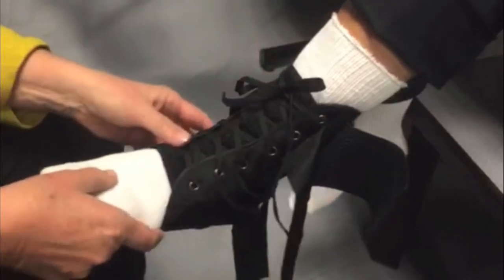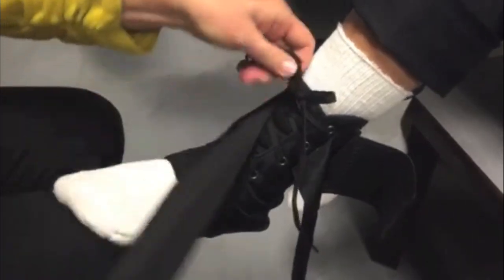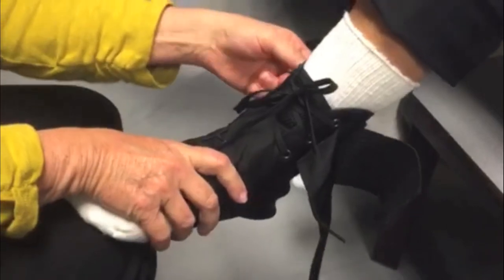Next, bring the inside or medial stabilizing strap across the top of the foot and under the heel. Attach the loop end of the strap to the hook side of the brace on the medial side.